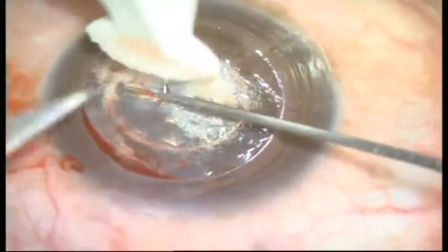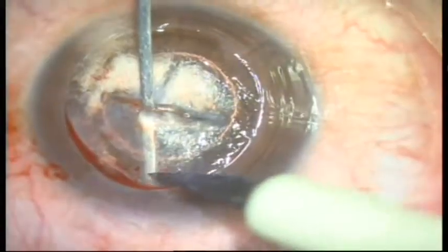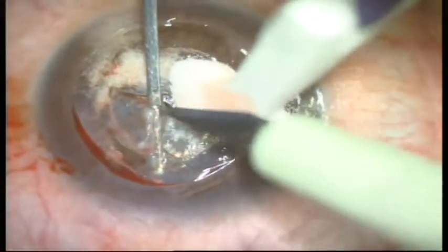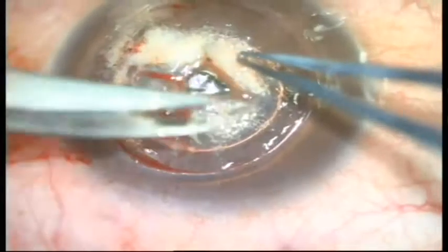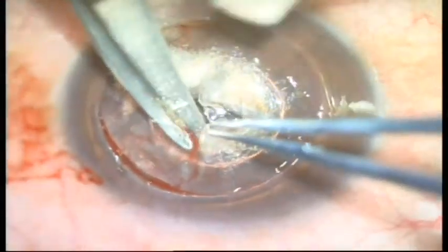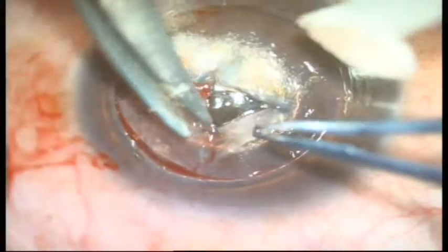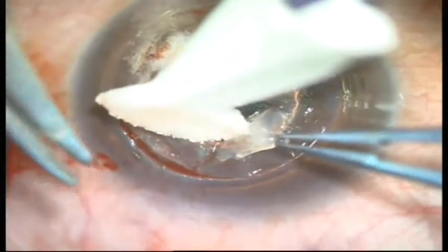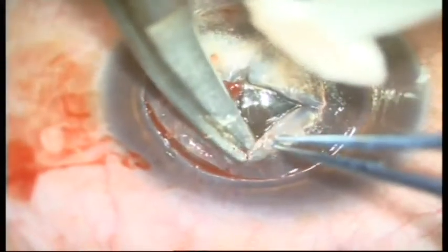But having no resistance at all between the stroma and the corneal endothelium means that the spatula is in the right plane. Dividing the 4 leaflets of the corneal stroma and exposing the endothelium, taking care not to touch the endothelium in order not to open the Descemet membrane and the endothelium. And of course, this is a type 1 bubble.